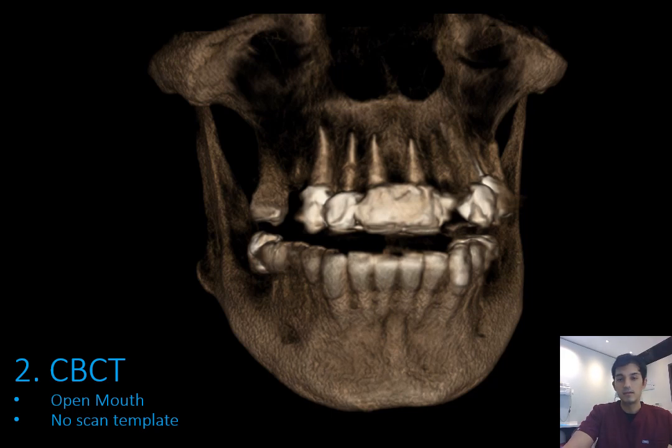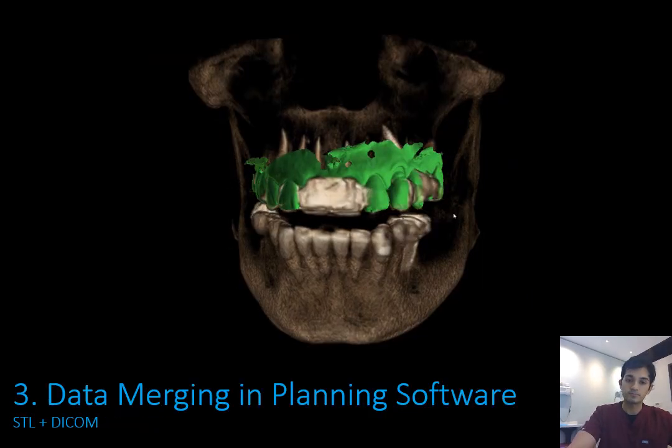Now in this case, we had the CBCT available to us from a couple of months previously when we were planning his posterior right maxillary area, so we did not expose him to additional radiation. We did not want him going into that room unnecessarily, again to minimize the risk and limit the contact of the patient with the various parts of the clinic. So we used our previous scan data, which had the benefit of giving us the prosthetic tooth as well.